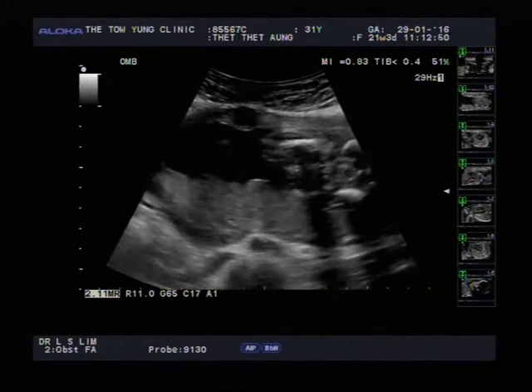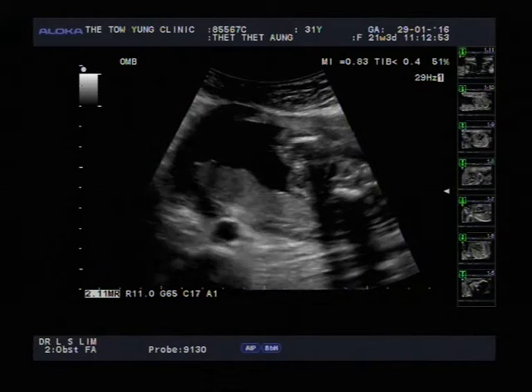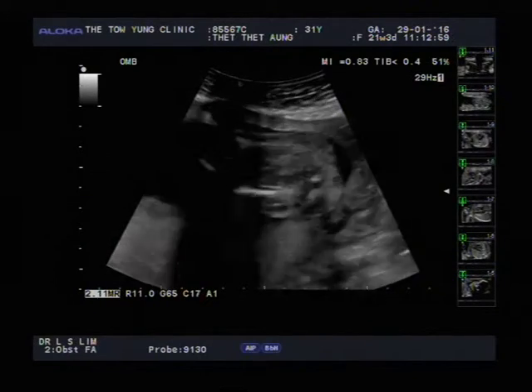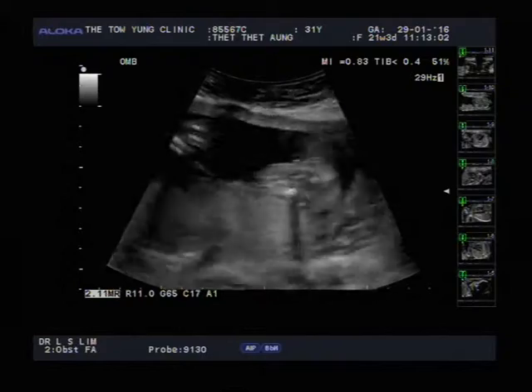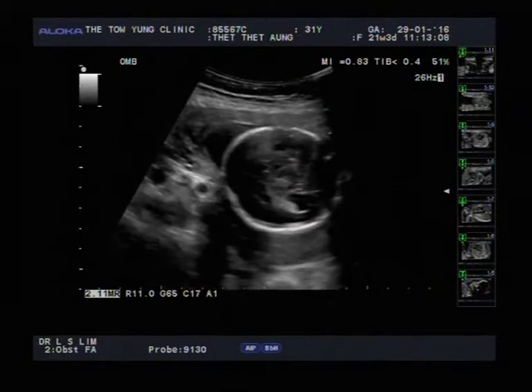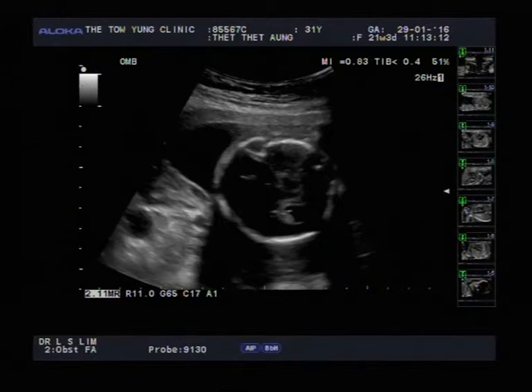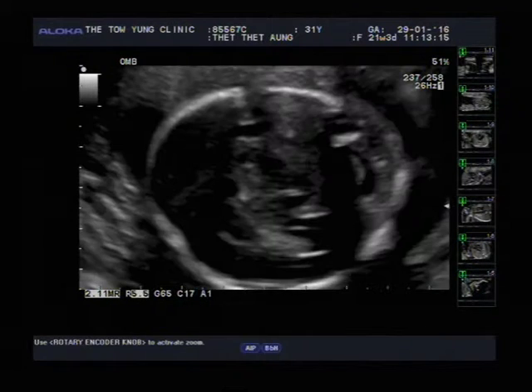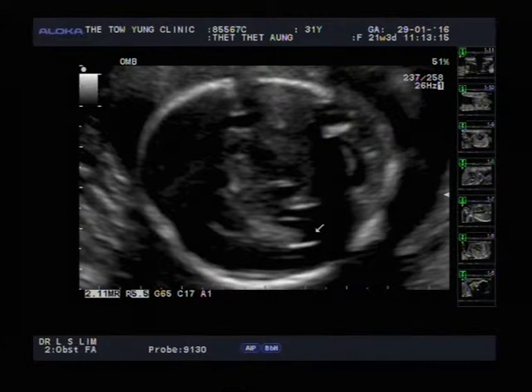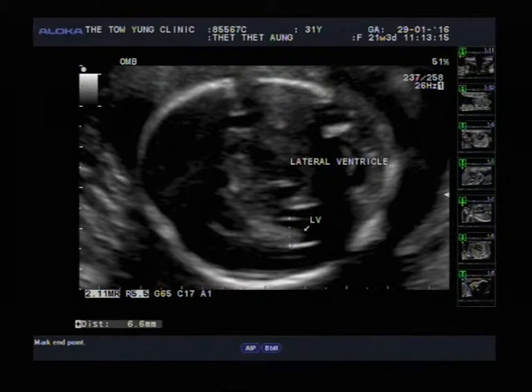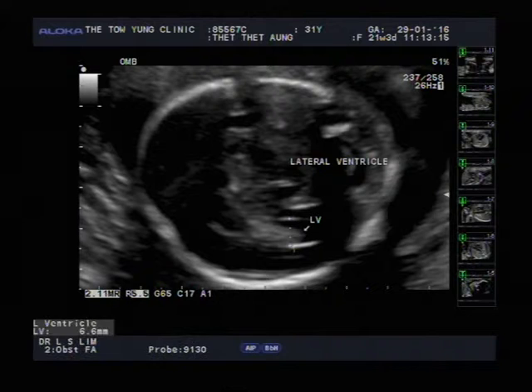From here we're going to move on to the upper limbs. Now for the upper part — the upper limb. Let me go to the head again, as I still need to check the posterior brain and the lateral ventricle. This part of the baby's brain is the lateral ventricle — the name is written down here — and we do the measurement.